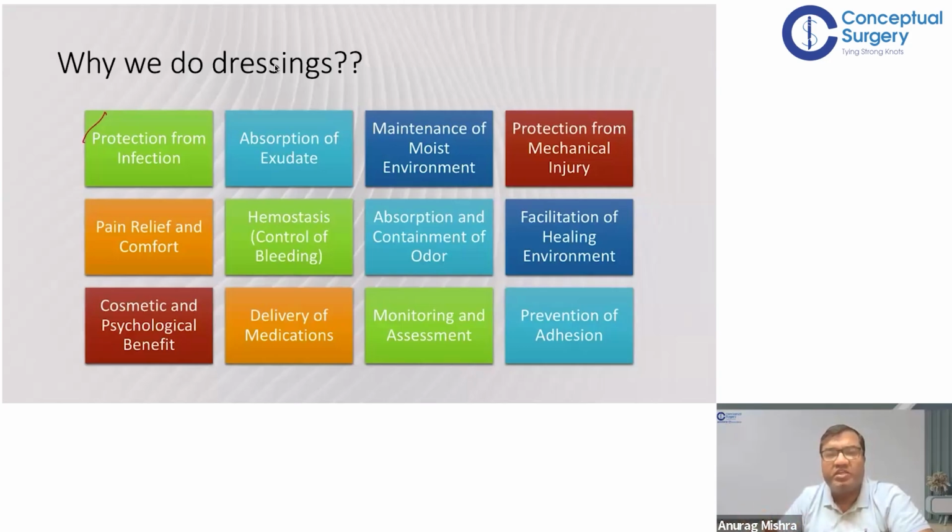The wound looks clean, there's no odor and all that. A healthy environment is provided. It is cosmetic. Obviously, nobody likes the sight of a ghastly wound where pus is oozing and all that. But if there is some dressing, the patient's psychological state is much better. The patient can talk, meet people, can go out because the dressing is done properly.